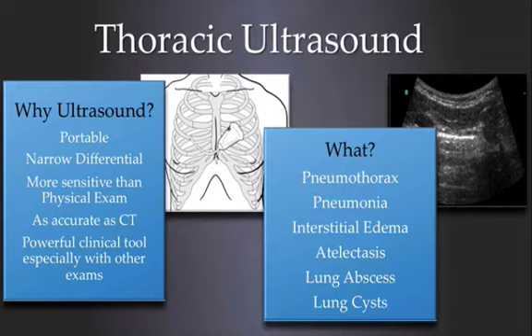Ultrasound is more sensitive than the physical exam. It's actually more sensitive than your stethoscope, and it's probably as accurate as CT. So this is a really powerful clinical tool to use on our patients, especially when you combine it with other things such as your physical exam, x-rays, and those other modalities that you're typically using.